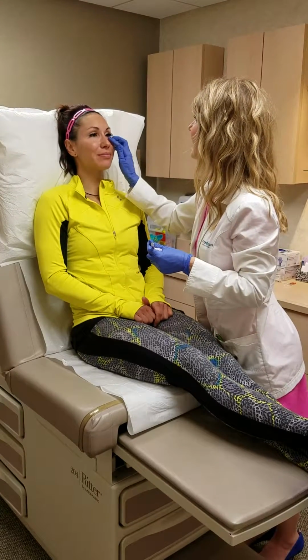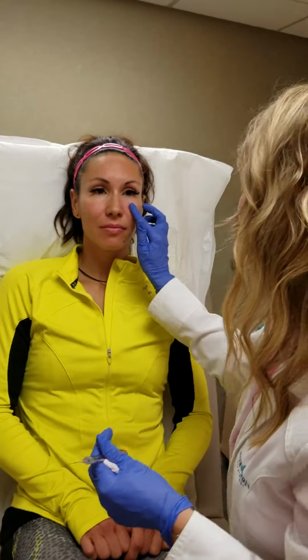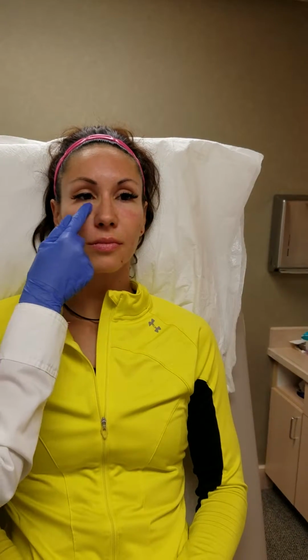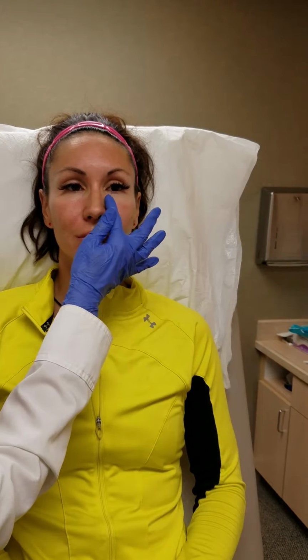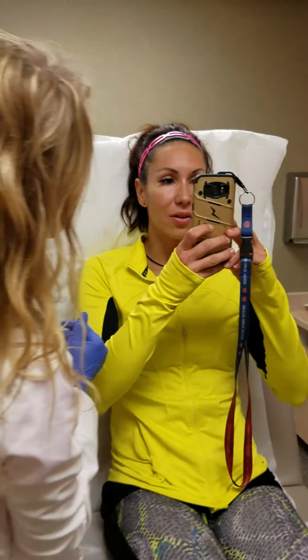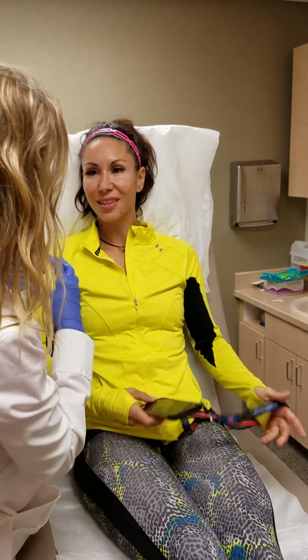Oh, I love that. You guys see the difference when you just have a relaxed pose, and the difference in the overall arch there and the cheek. Yeah. I mean, it's pretty. I'm excited to see it. No smile, just kind of flat affect. So you can see this is the area of volume loss on this side. We added just a smidge right here. And maybe we should let you take a peek, Maggie, so you can see. Oh, yeah. Can you see that difference? Yeah. Super subtle. But really, subtle's the nicest.